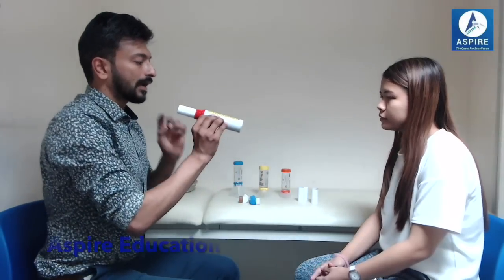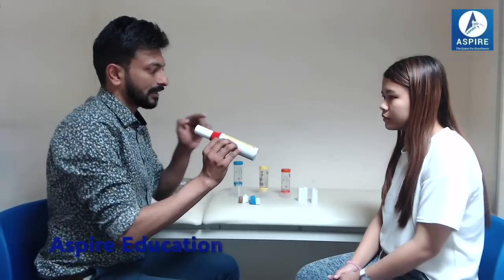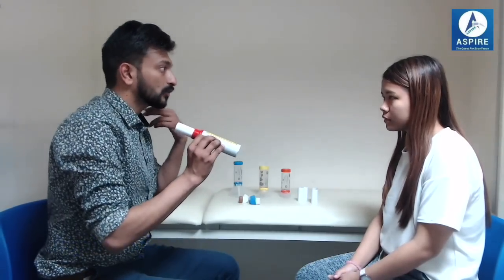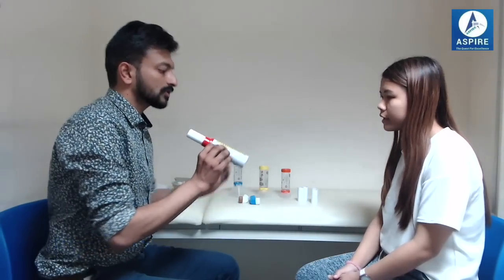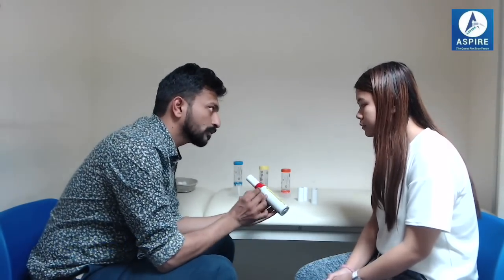Sit upright. What you have to do is take a deep breath in, make a tight seal around this mouthpiece, and blow as hard and as fast as you can. So you will be getting one reading. You have to take three readings in the morning and three readings in the evening, then plot the highest reading on the graph or on the asthma diary.